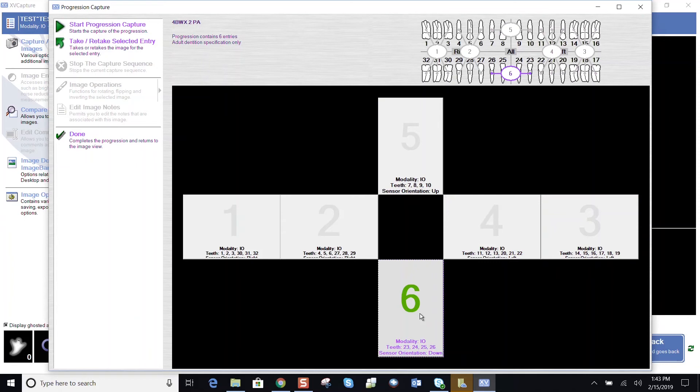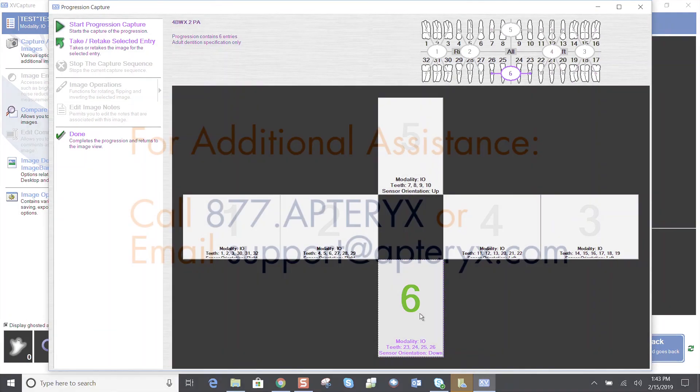Closing that application, and when you open up XVCapture, your new layout will be available to you. Quick tutorial on creating progressions, layouts, in XVCapture.